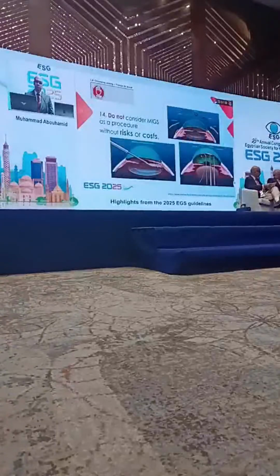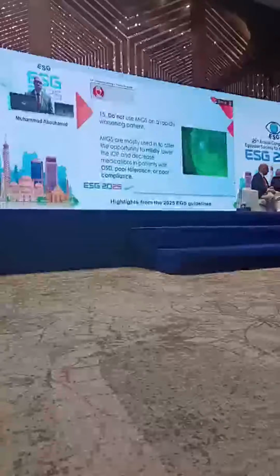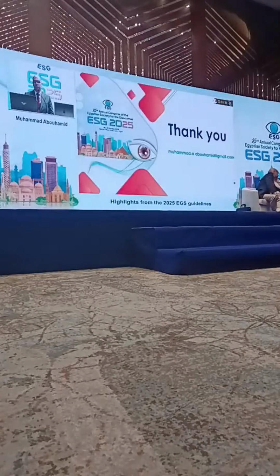Do not consider MIGS as a procedure without considering the risks or the costs. And finally, do not use MIGS on rapidly worsening patients. MIGS in general are best suited for patients who have mild to moderate disease, a bad ocular surface, or compliance or bad tolerance. For more information, please refer to the published guidelines, and thank you for your attention.